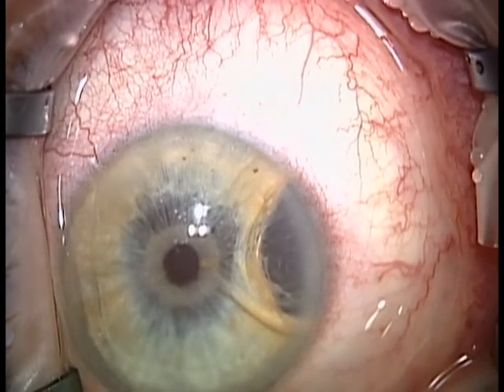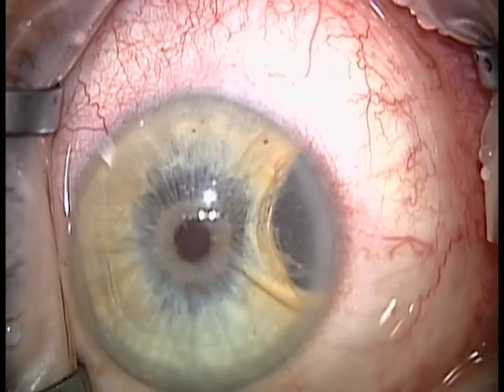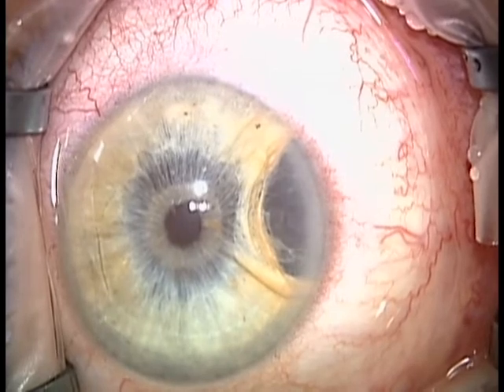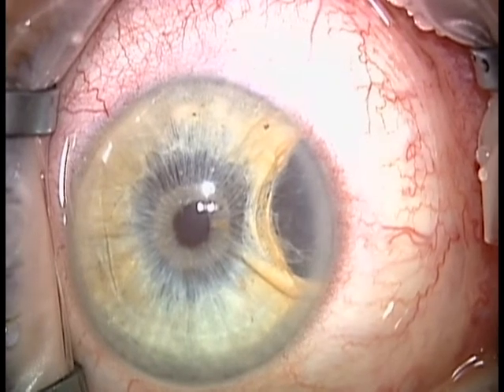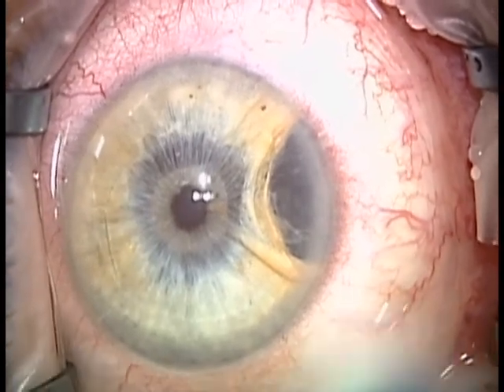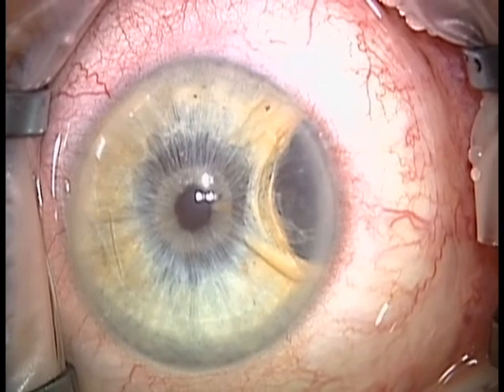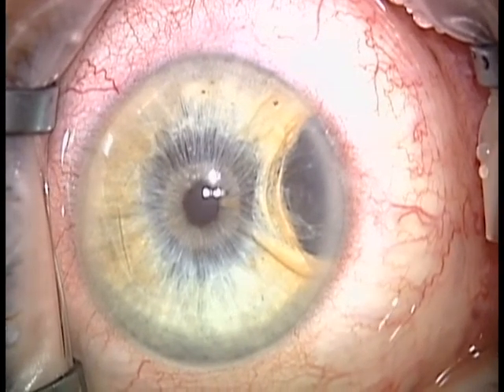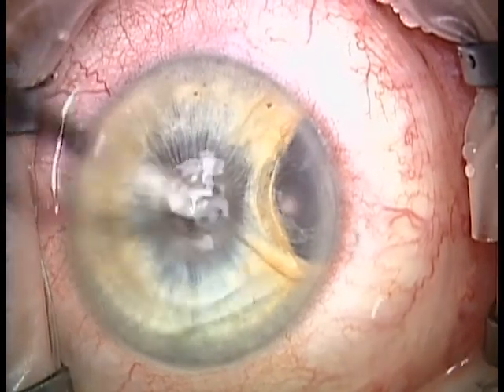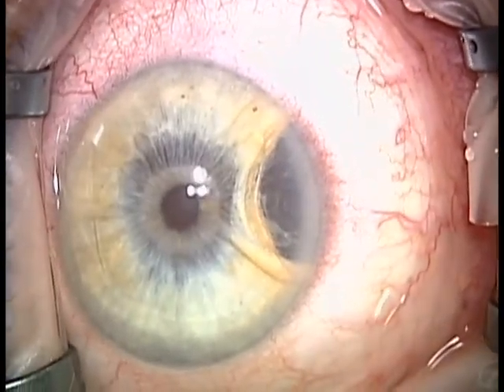This was first reported in 2003 in the Journal of Ophthalmology by Zora Baruzzi and Kodidust. The injection technique was further modified by Carol Shields in a paper in JAMA Ophthalmology in 2014, and this video presents a further modification of the injection apparatus.